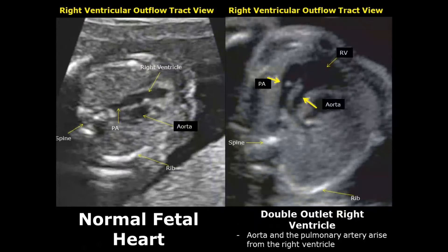In a double outlet right ventricle, we will see two arteries arising from the right ventricle — both the aorta and the pulmonary artery arise from the right ventricle.